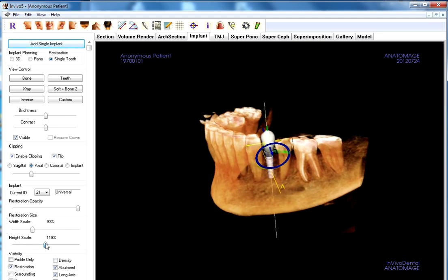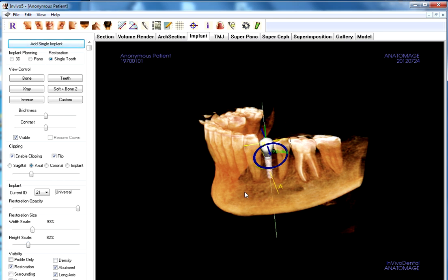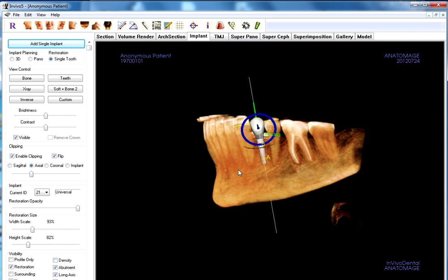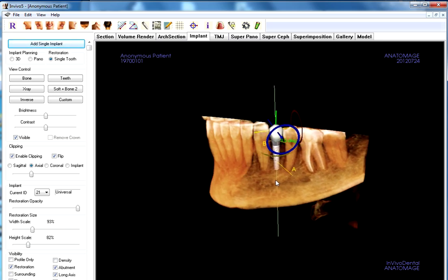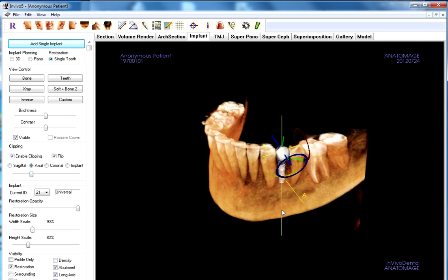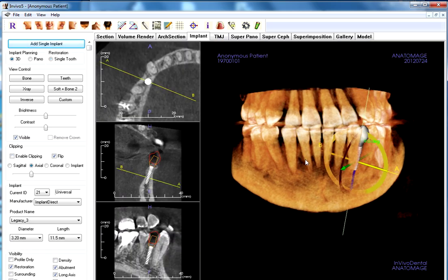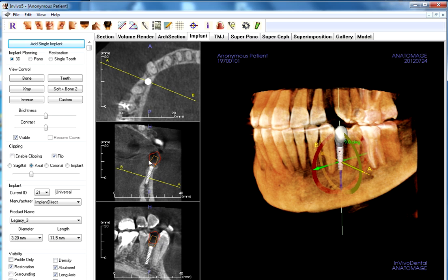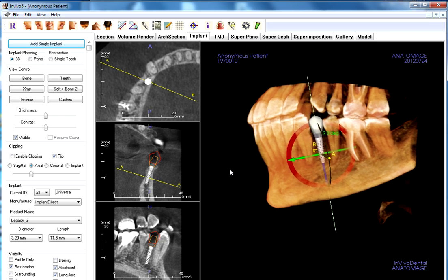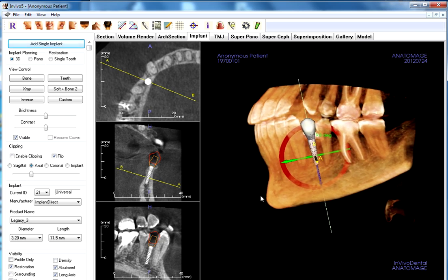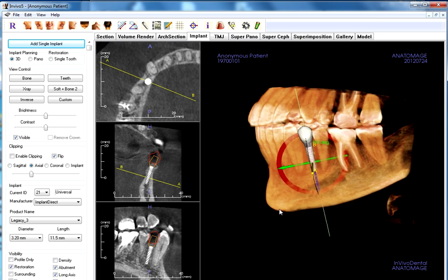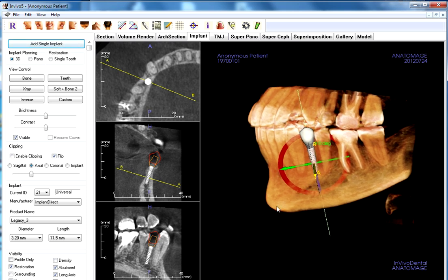I can also adjust the height of this and get it right to where I want. This is just for demonstration purposes — I'm not going to have a CAD/CAM milled restoration or abutment from this software. I'm simply trying to get an idea of where this implant needs to be placed in relation to the restoration. If I go back to the implant screen, I can see the red outline of the crown and the orange outline of the abutment, and that's looking pretty close. I'd probably tweak it a little bit more, but this will work for this demonstration.